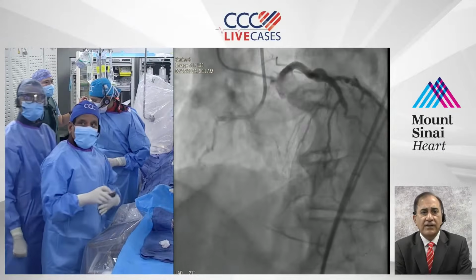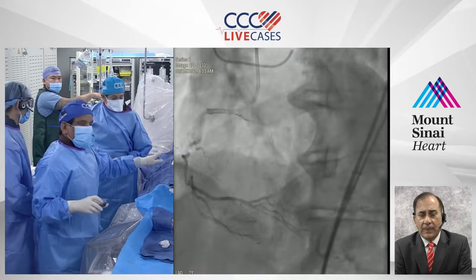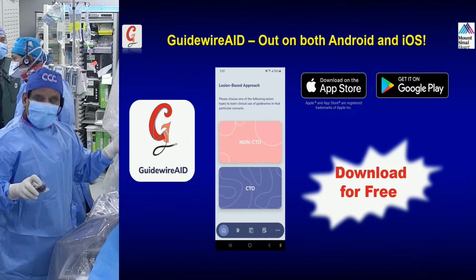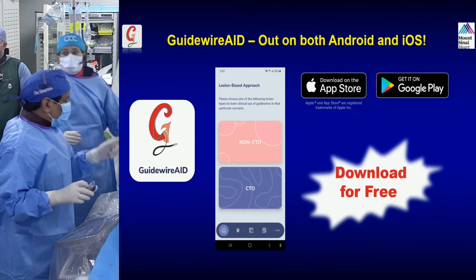Samin, both accesses are from the femoral sides? Both femoral sides. Okay. And we go to our slide presentation, and before we start, we'll have the plan: what kind of wire and what you are going to do. Tell your plan, and then you'll start and we'll continue.